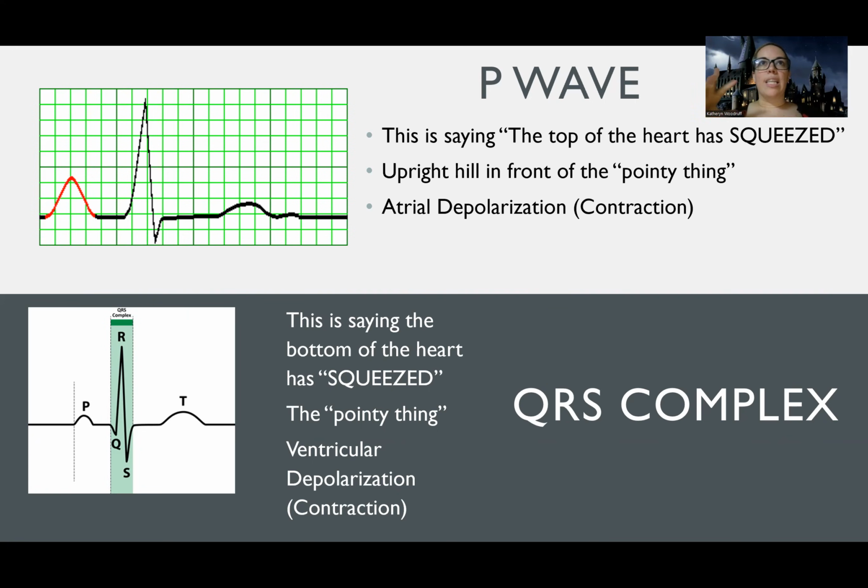So this is electricity. Let me back up a little bit before I get too crazy with this. There are two main parts of the heart: the electrical function, and then the pumping or mechanical function. What we're looking at with EKG is the electrical activity. We're seeing what impulses are being sent. Now, you can have electrical activity and no actual squeeze, but the majority of the time, if you have this electrical activity, it is telling us the heart has squeezed.